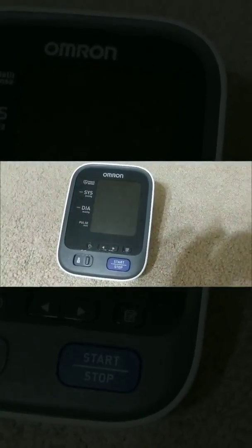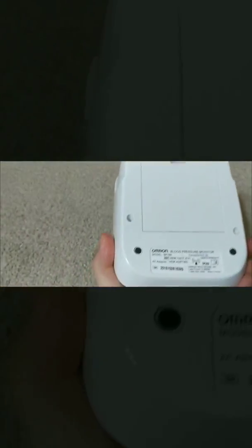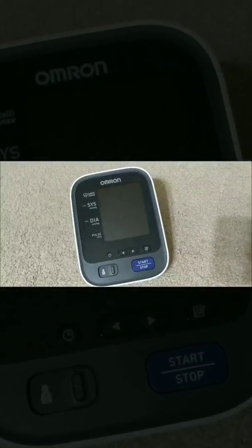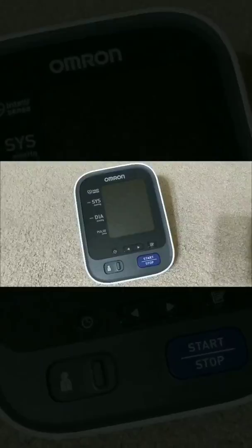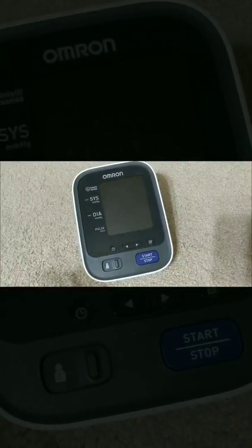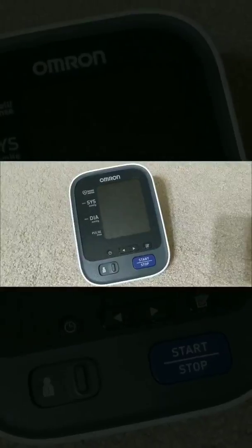Hey guys, I finally figured out how to get this Omron BP-786 to pair successfully. I figured out that during pairing, if your phone or the Omron app sees any other Bluetooth device, the pairing process will fail. I'm going to show you guys step by step how I've been able to replicate the failure and also a successful pairing.